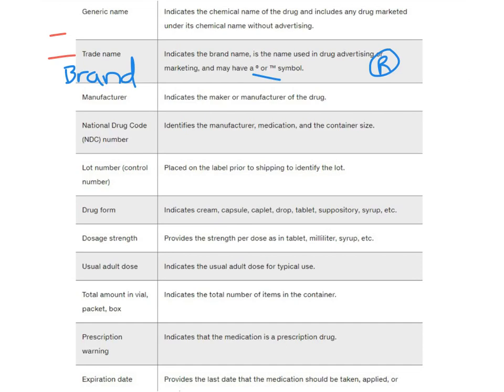The third thing you guys are looking at there, the manufacturer. This is the name of the company that manufactures the drug, that produces and makes that drug. So you've probably heard of a lot of common manufacturers of medications like Pfizer, Eli Lilly. We're going to see some different examples, and some of them might be made up in the examples that we'll look at, but oftentimes it's real easy to spot the manufacturer because their logo is on the label, or sometimes it might even say manufactured for, and then it gives the name of the company. We'll look at some examples here in just a second.